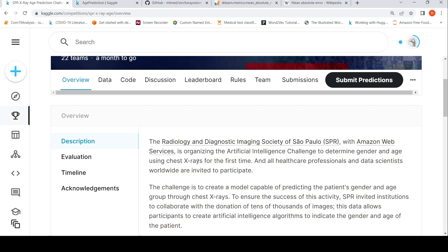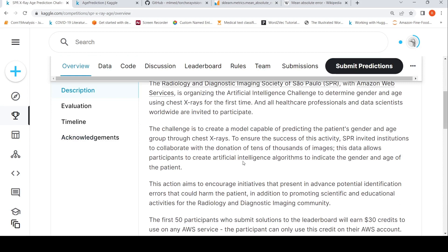In this particular video, I am looking at the age part of it. The idea is that this initiative aims to encourage advanced potential identification of errors that could harm the patient, in addition to promoting scientific and educational activities for the radiology and diagnostic imaging community.